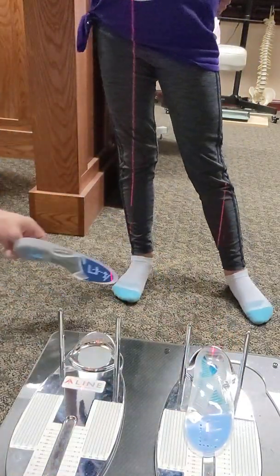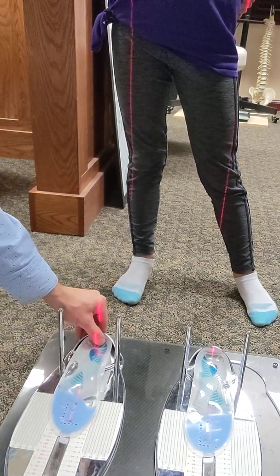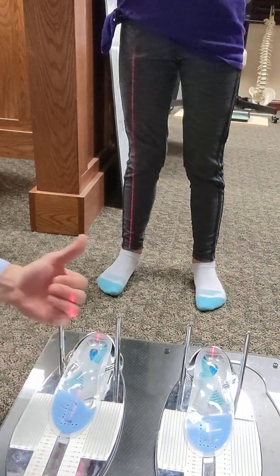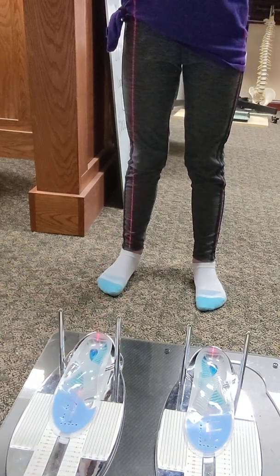We're going to put in the A-Lines. The reason I like the A-Lines is, number one, they're probably the most worn orthotic for athletes. And they're very functional — you can see this dynamic bridge, so it actually helps put motion into the foot. You can actually see a foot strengthen by wearing an A-Line.